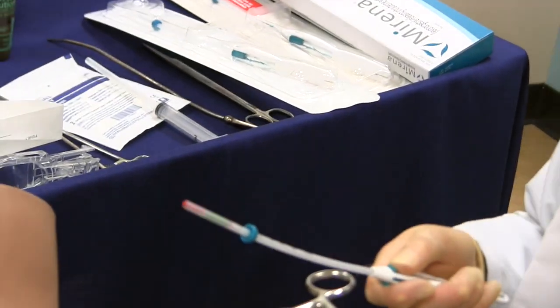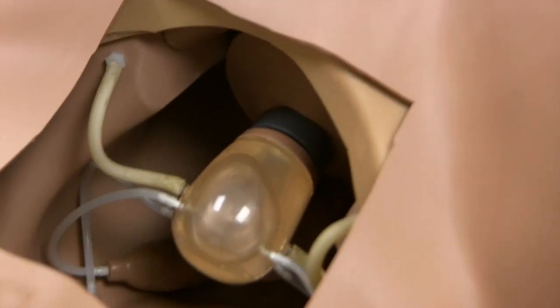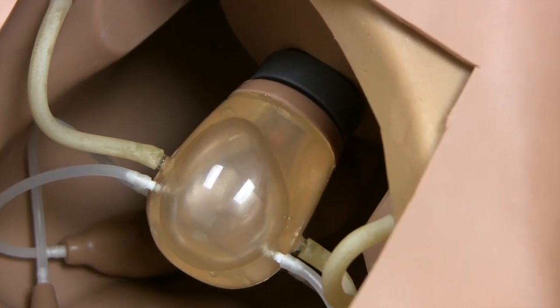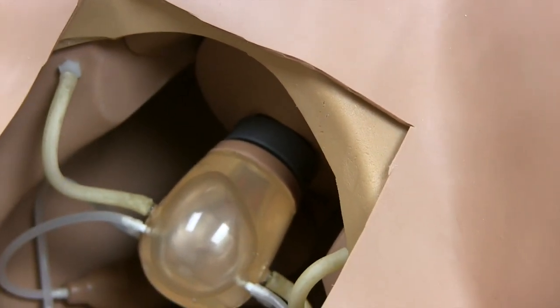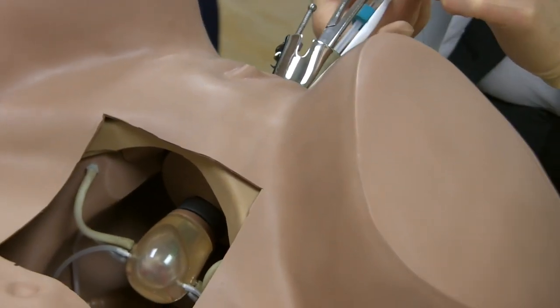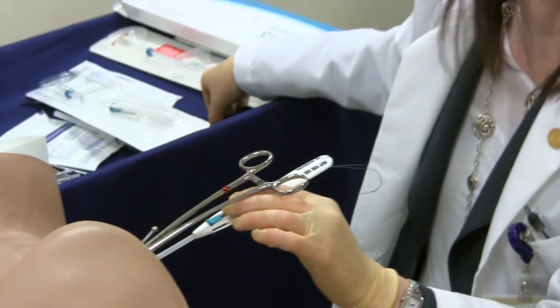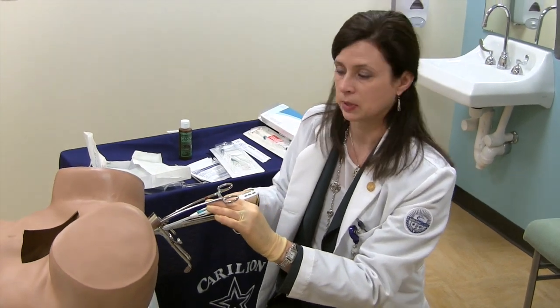Moving back to the model itself, it's easy to insert the IUD through the model and visualize on the other side exactly what is going on — to talk the learner through opening it up to the first line for the release of the arms, gently advancing to the fundus, and having them stand up and take a look at what that looks like on the other side, and then finally to completely release the IUD. We don't recommend students practice cutting the strings because otherwise you can't use them again, but talking through the length at which you would want the string to be cut is also helpful to discuss.